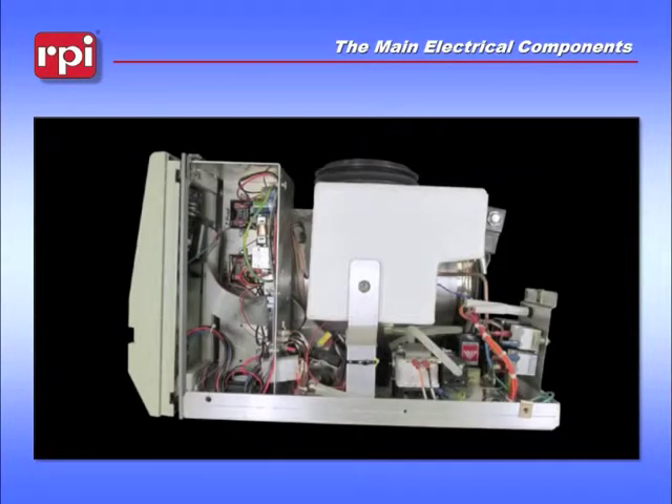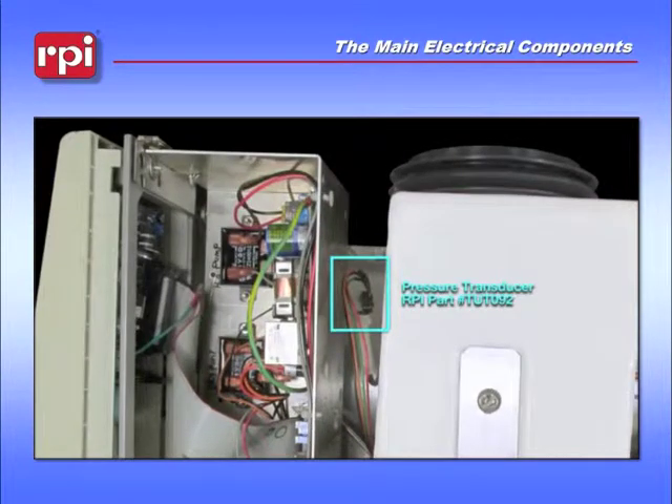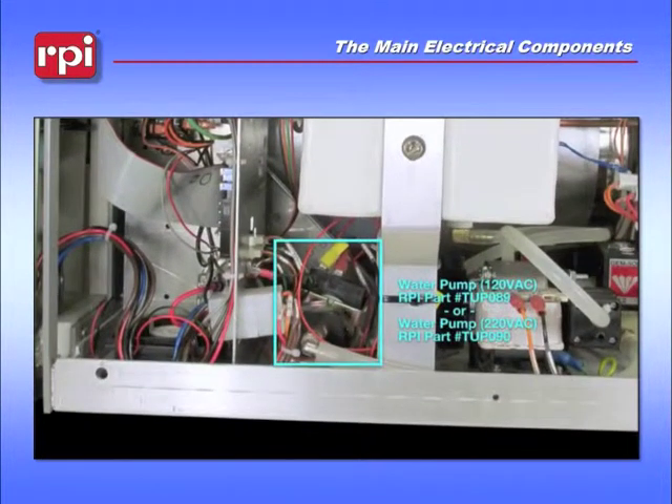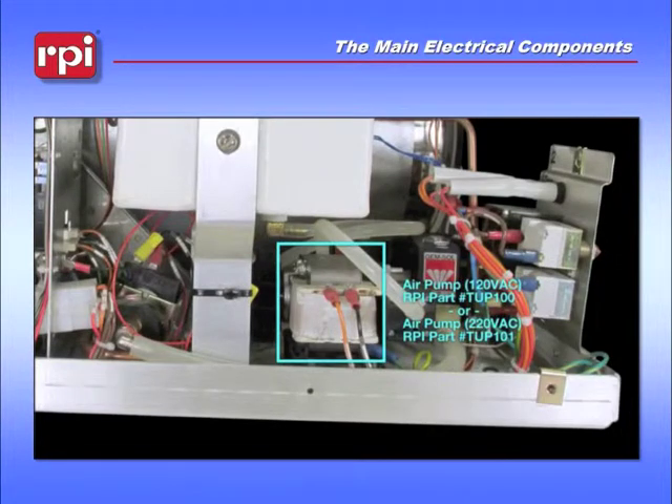To look at the side of the unit, in between your reservoir and the bracket will be your pressure transducer. And moving down below the water reservoir will be your water pump, available in 120 volts and 220 volts. Just to the right of that will be your air compressor, also available in 120 or 220 volts.